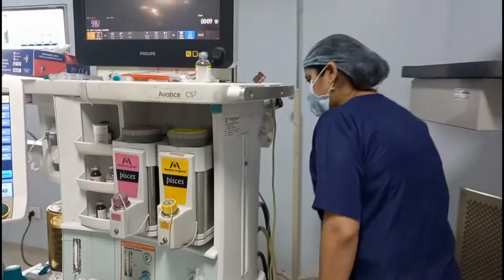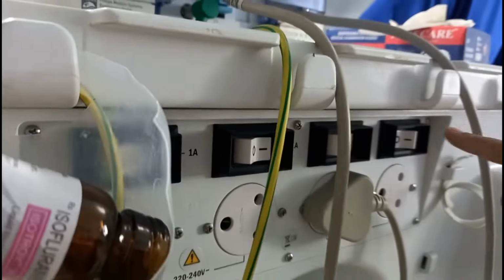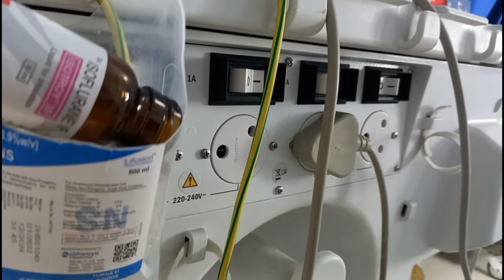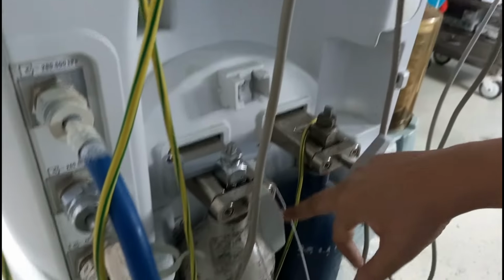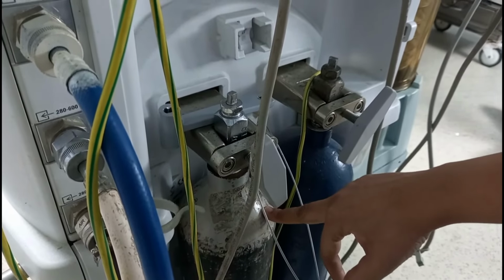Now coming on to the electrical component again, here there are electrical outlets which you can see at the back of the machine. These electrical ports are for attaching the circuits. As I had discussed with you, high pressure system has hanger yoke assembly. So this hanger yoke assembly is in this modern anesthesia machine. This is hanger yoke assembly which is giving an attachment to the cylinders.